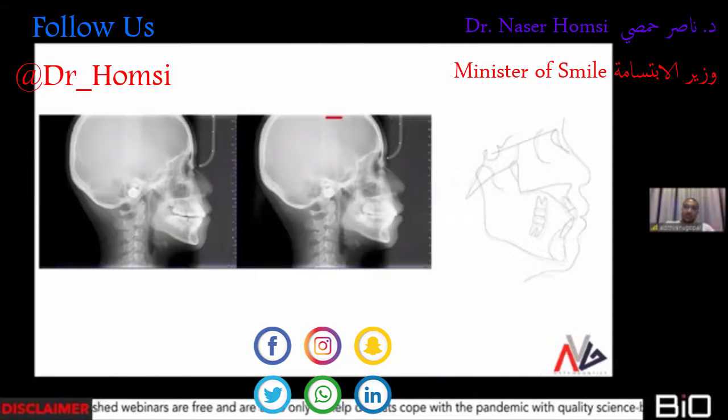But yes, as you can see, the upper incisors over here have proclined in the superimpositions. The lowers have not proclined much, but still, in this particular case, I was able to alleviate the crowding. The second case that I showed you, I wasn't able to do that. I waited for about a year and nothing happened. So what I'm trying to say again is you can't use the same appliance on all patients and expect the same or similar outcome. It's not going to happen.